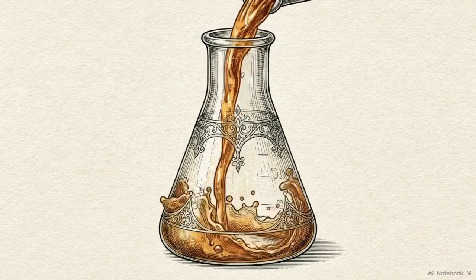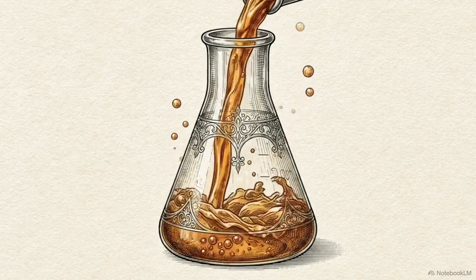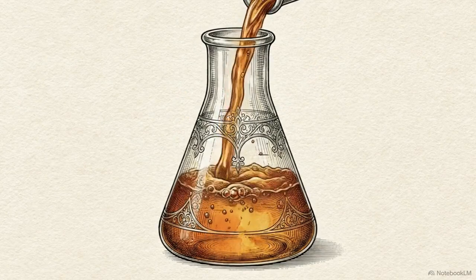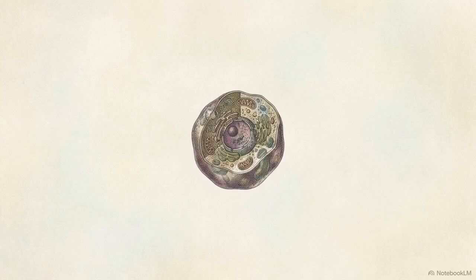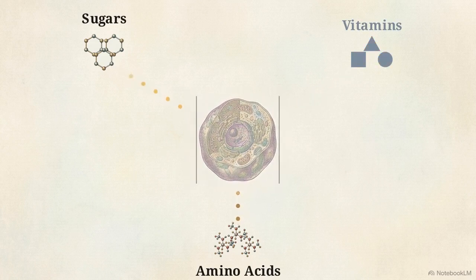These systems perform highly specialized tasks, synthesizing pharmaceutical proteins, replicating DNA, or modeling disease mechanisms, all within a controlled liquid growth medium. The fundamental constraint of this work is that a living cell only maintains its complex organization and metabolism when provided with an exact, organism-specific set of exogenous biochemical inputs.